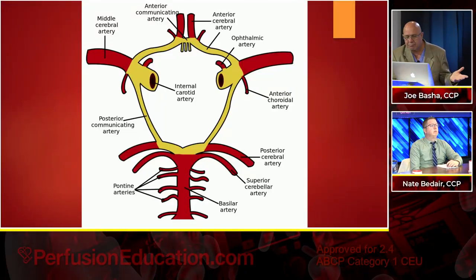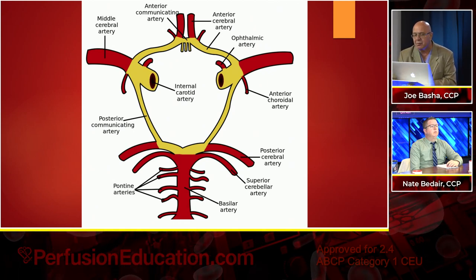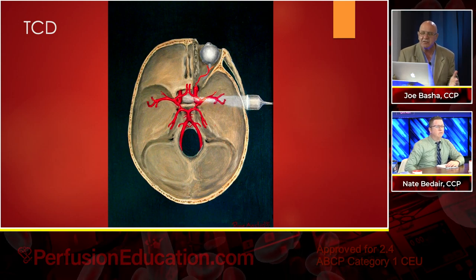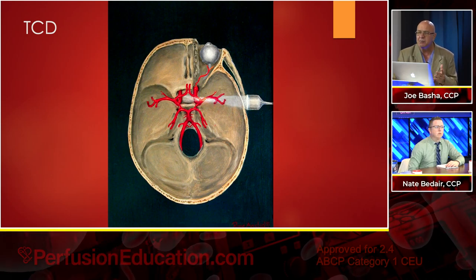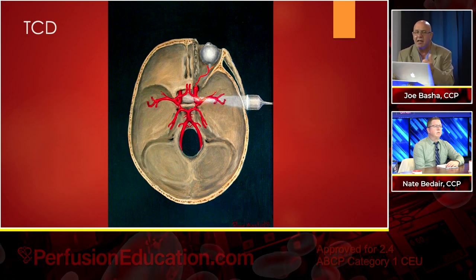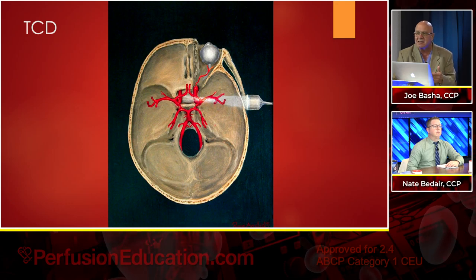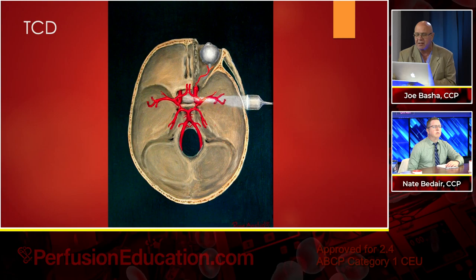Here's basically cerebral blood flow anatomy. We're all familiar with it. I won't go over it too much. Transcranial Doppler takes advantage of the middle cerebral artery, which is what you're seeing there, and it looks at the one coming toward it and the one going away from it on the contralateral side. You can tell on the TCD device, if it's red, it's coming to you. If it's blue, it's going away from you. You could have two channels.